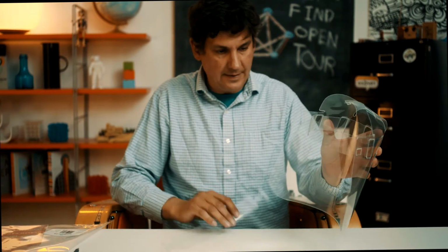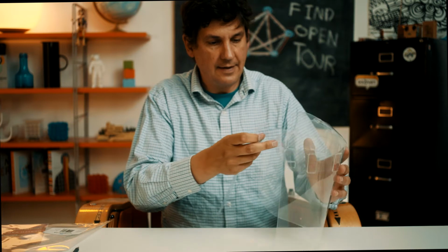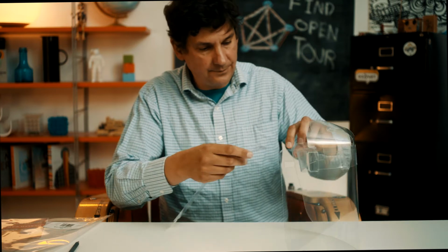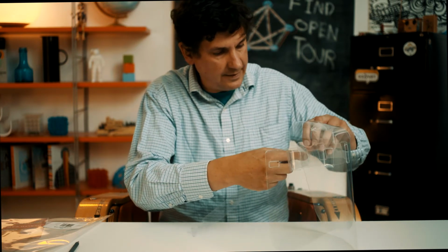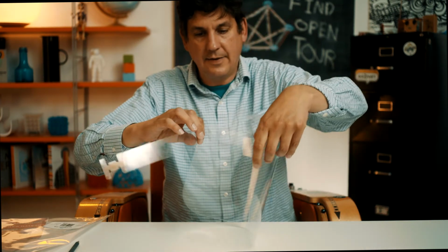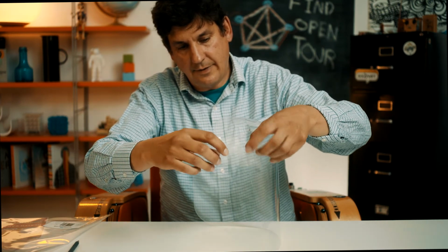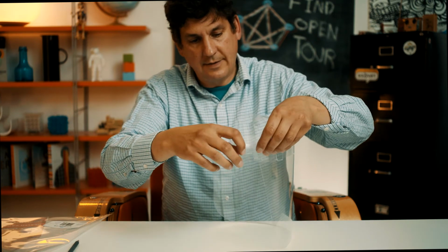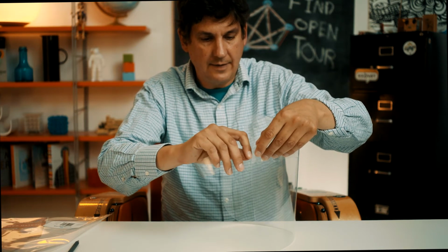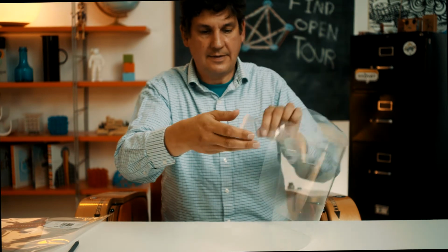The next thing that we do is we take the headband holder and we take either side with this hook, and there's a rectangular hook and there's a square kind of object as well. So we can put this one in here on the one side, and then we take the other side, and there's 3 different sizes again. We can either slot in here the rectangular hook, or we can slot in the square hook depending on how tight you want it. So I'm just going to put the one that's the outer one, the rectangular hook, and we add that in there, and that gives us our headband.